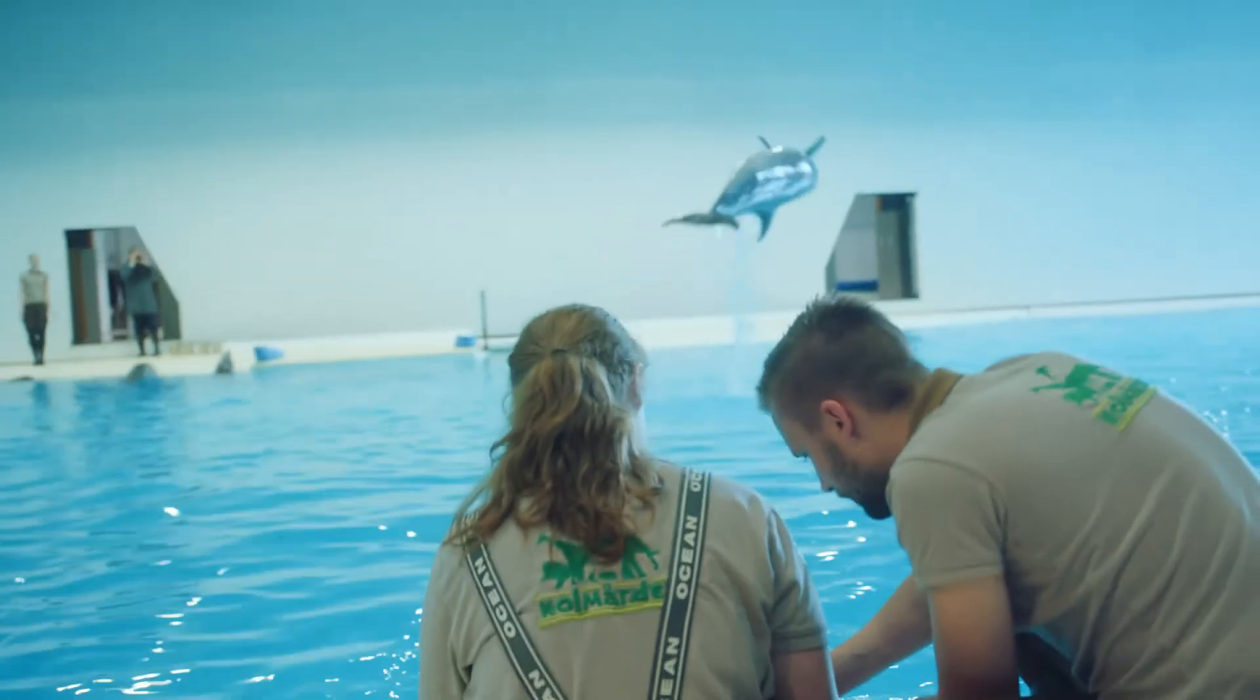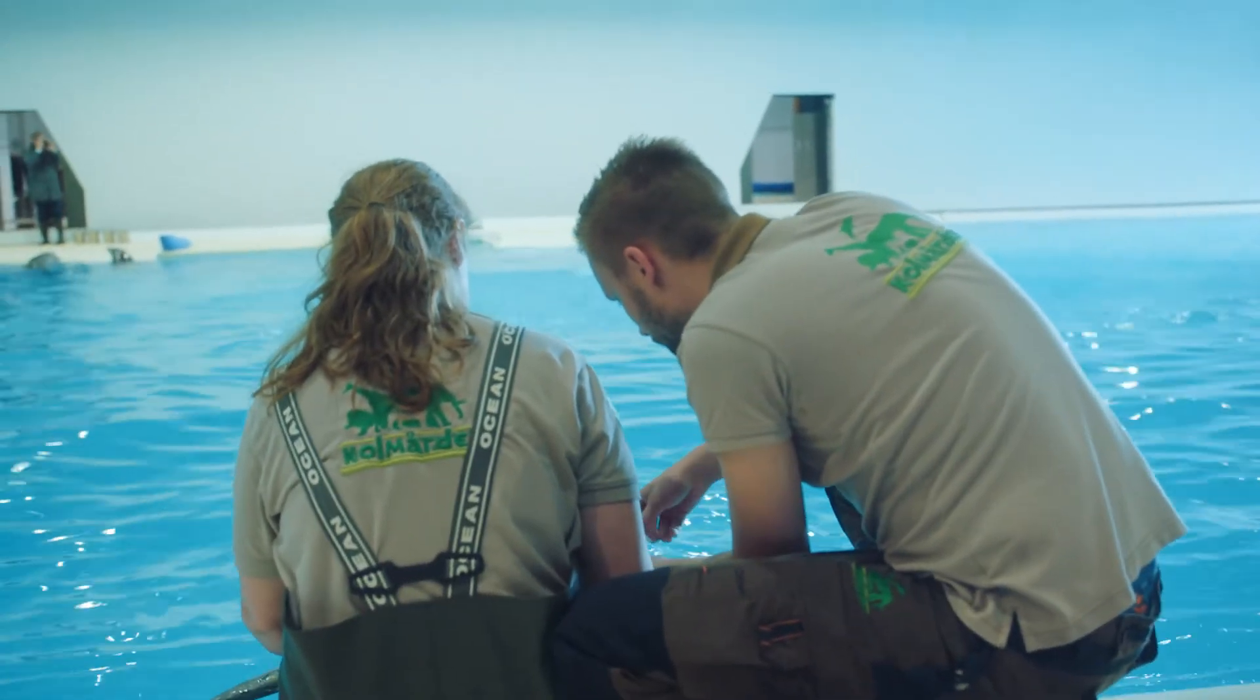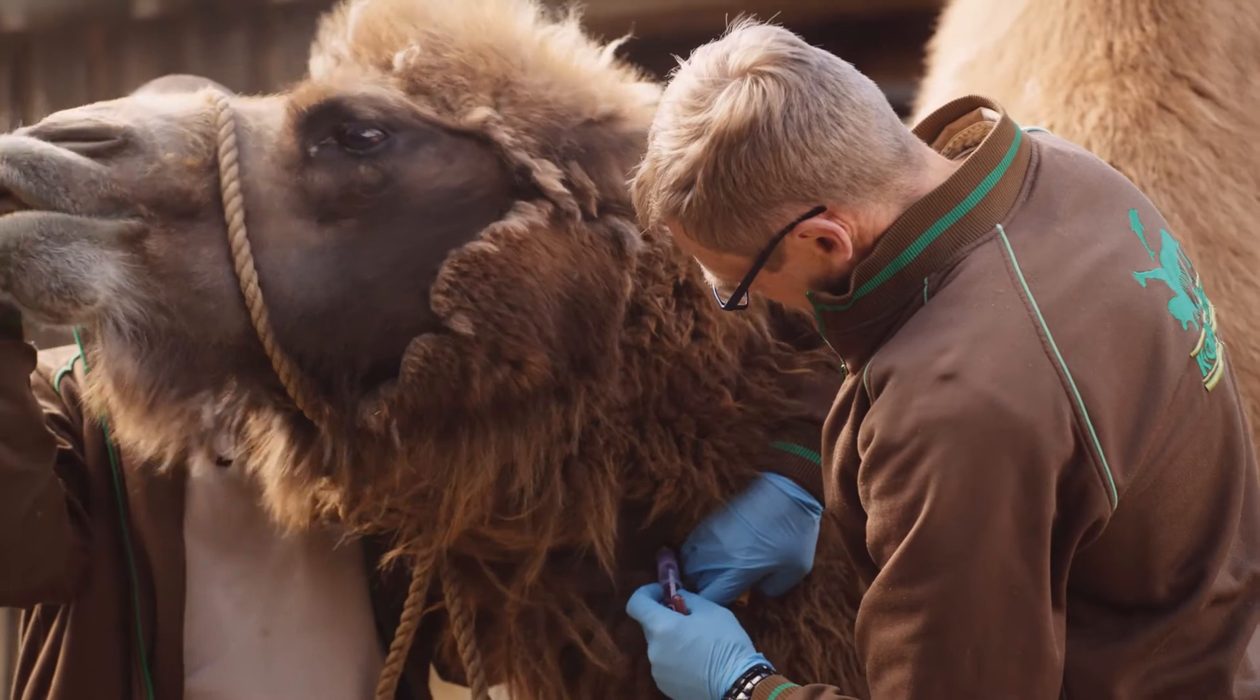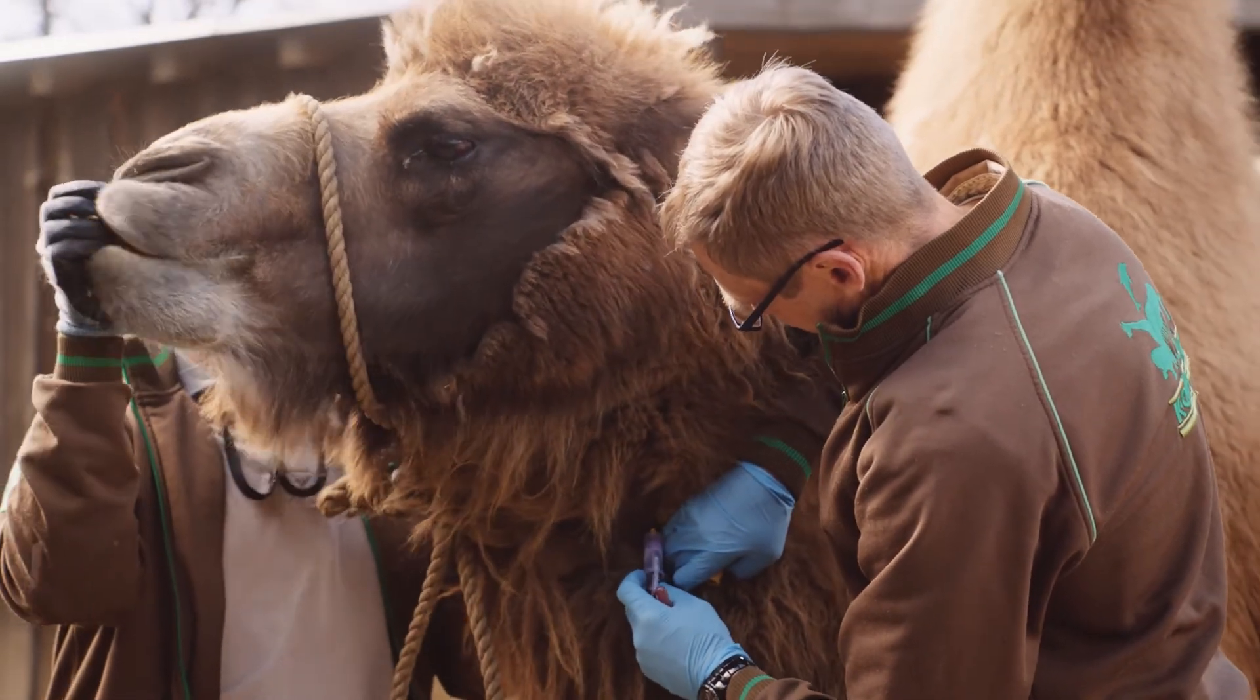Exego users globally have added more than 50 different animal profiles to the analyzer. These have been added through following our internal procedures with settable software adjustments to adapt to the varying morphologies of different animal species' blood cells.